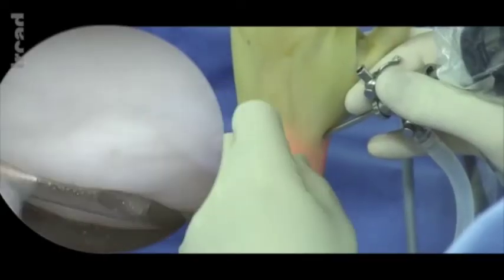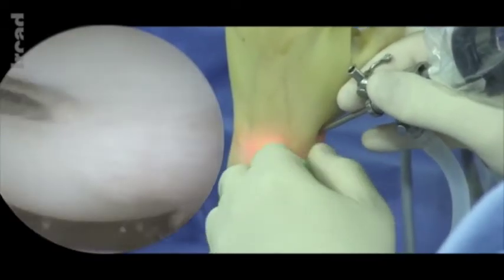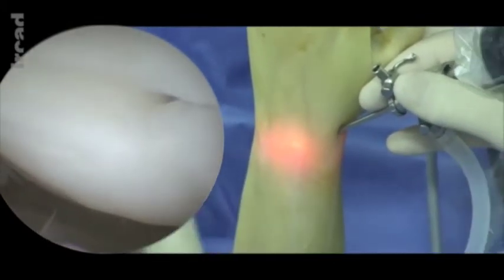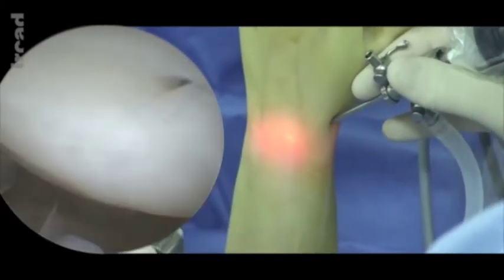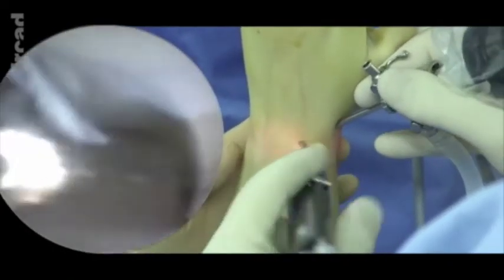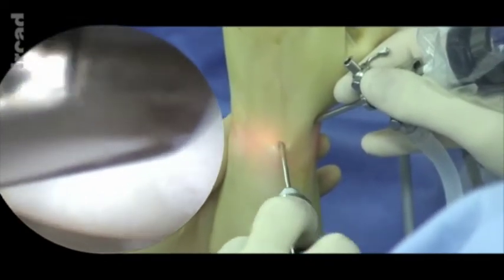Using a needle, the lunate bone ganglion will be very easily identified by passing through the intermediate portion of the scapholunate ligament, which has no mechanical influence and which is not vascularized. A shaver will be passed through the 3-4 portal to enter the bone ganglion and initiate the curettage of the inside part of the lunate bone ganglion.